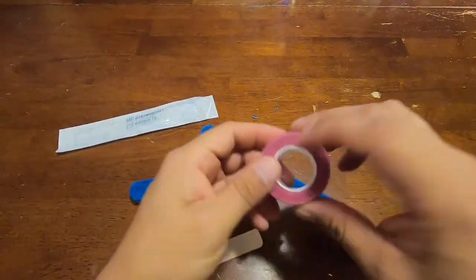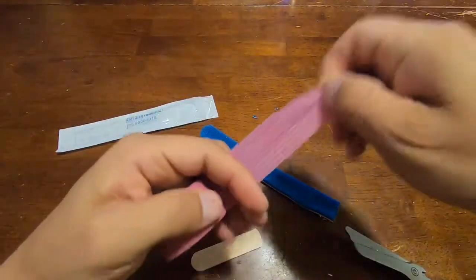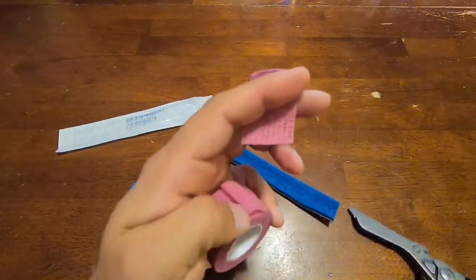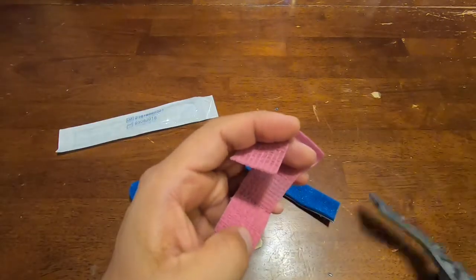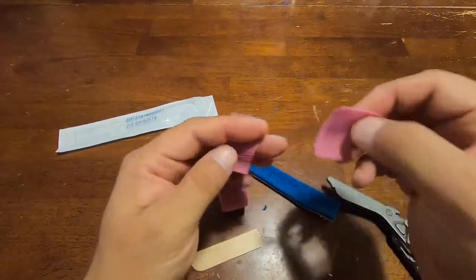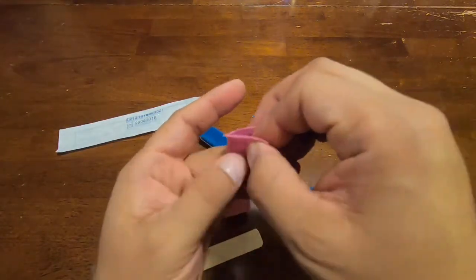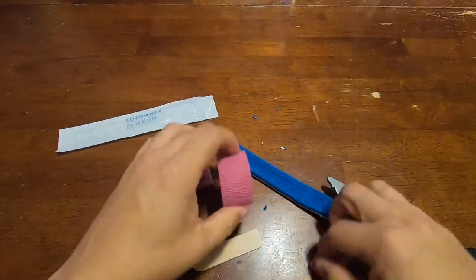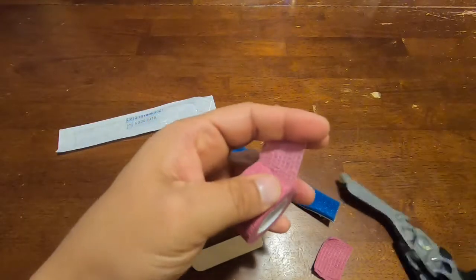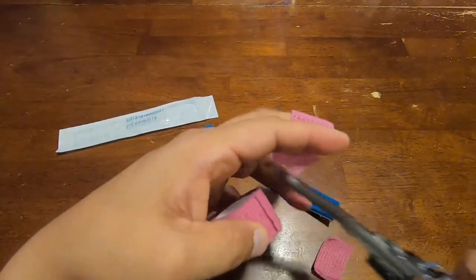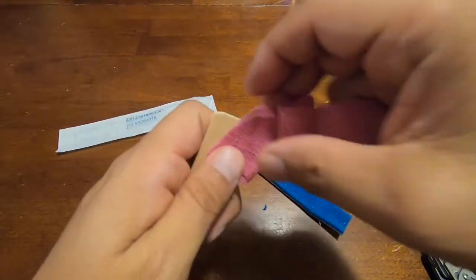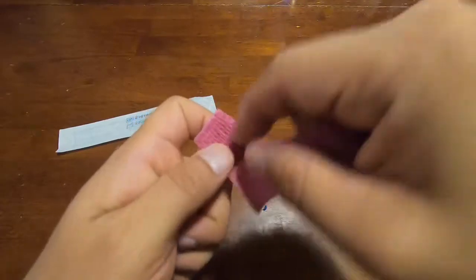And then you know, we'll just get you a couple of strands of the Coflex, shorter strands. Just make it a little easier, we'll just kind of slap them together right now, and then just get a longer strip.